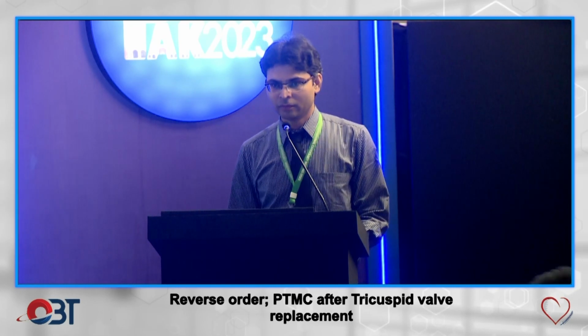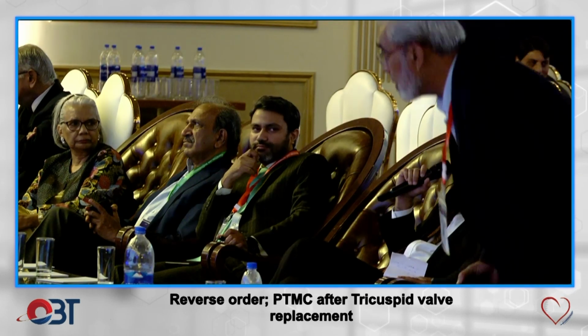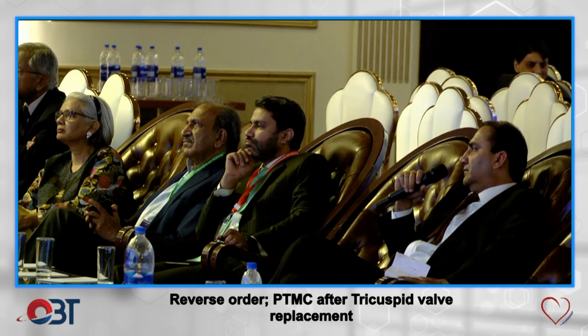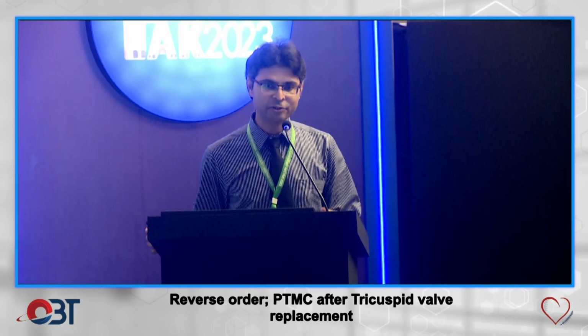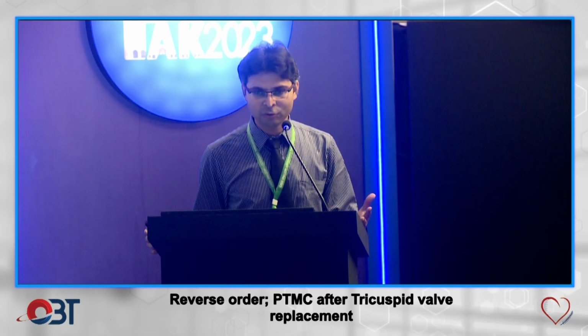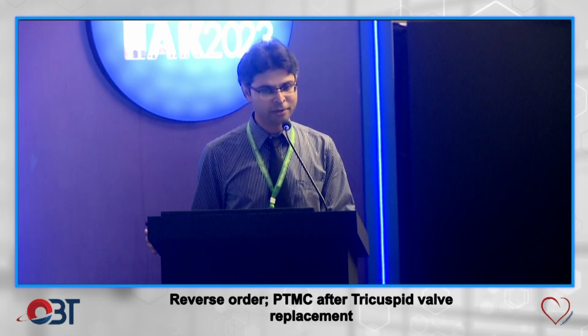एंटीकोगुलेशन का भी इशू, उसमें INR का थेरापेटिक क्या रखेंगे अगर ट्राइकस्पिड वेल्व और माइटल वेल्व रिप्लेसमेंट हो? बहुत मुश्किल है. This is not an issue of maintaining the INR because the patient was already taking the warfarin, but it was the risk of the surgery that we have entertained before taking that patient for the PTMC. Patient was a 60 years old male who has already had a surgery, and if we took that patient for the redo, that might be high risk.